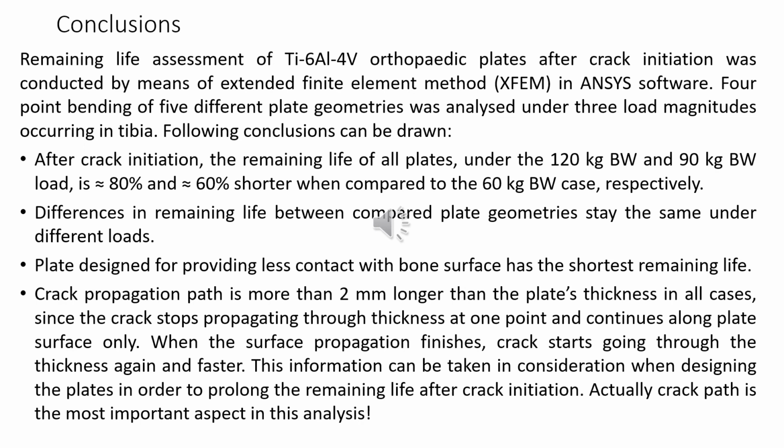So in total, its path is not only longer, but also different. And as already said, this is the most important conclusion, and this has to be taken into consideration when designing the plates so that we get as long remaining life as possible.